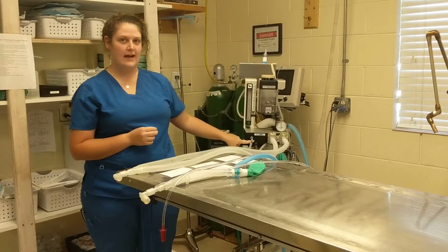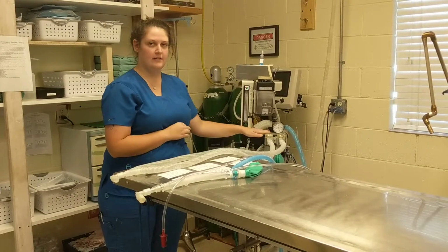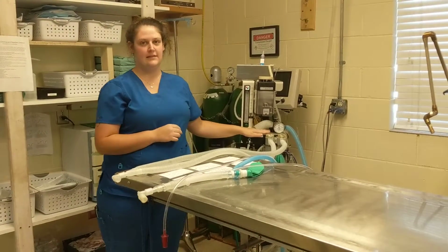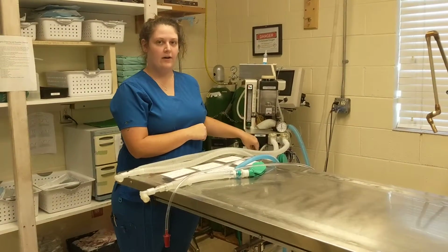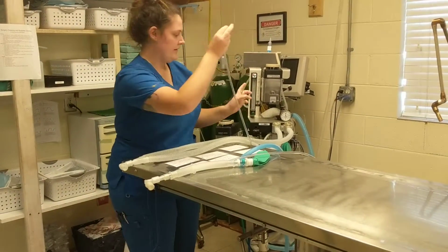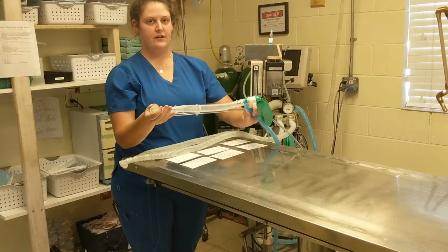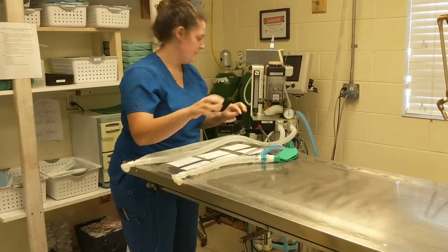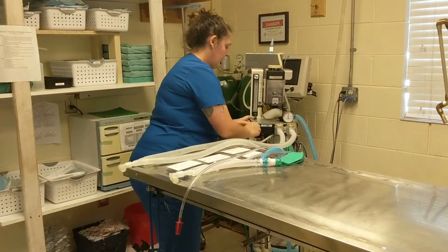This port acts as an attachment for our large and small machines. The large machine is like this one, and it's called a rebreathing system. This one is meant for patients over 7 kilograms or 15 pounds, and the small system attaches to the same equipment but through that port, and it's for patients under 7 kilograms or 15 pounds. I'm going to attach it back to my large system, again the rebreather.